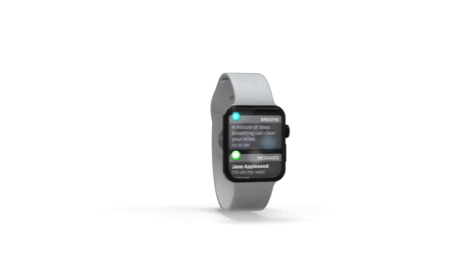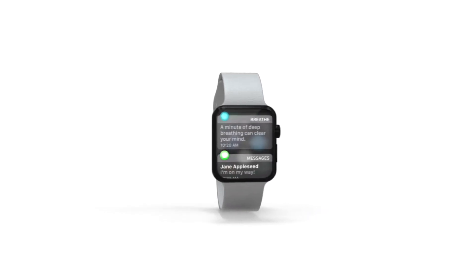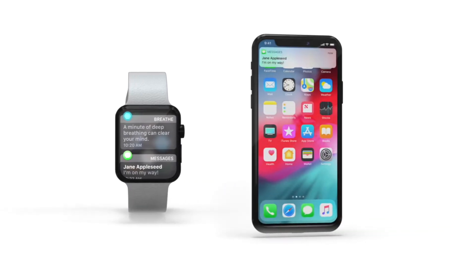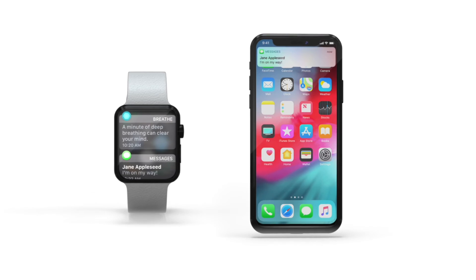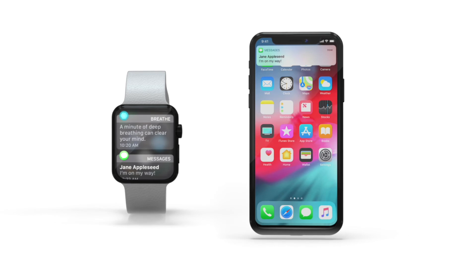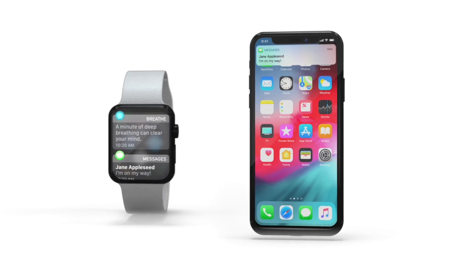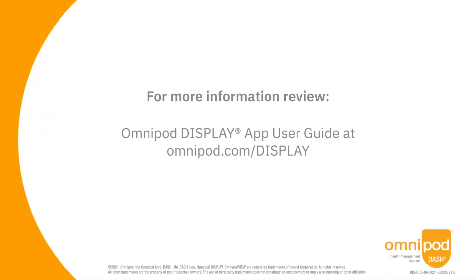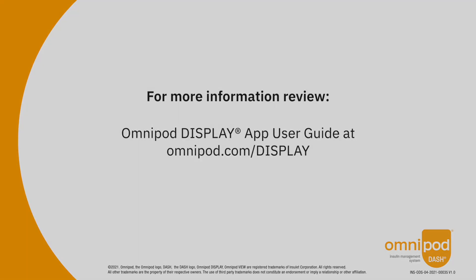Currently, with the Omnipod Display app, Apple Watch can receive notifications only. Notifications on Apple Watch are mirrored from your iPhone by default, so any app you have notifications enabled for on your iPhone will also appear on your Apple Watch.